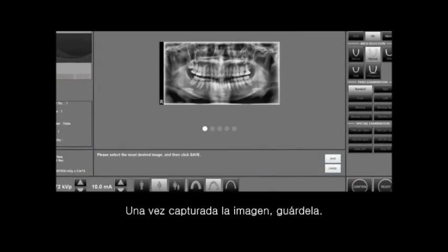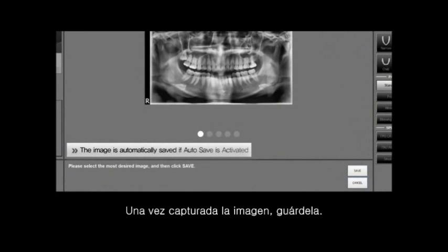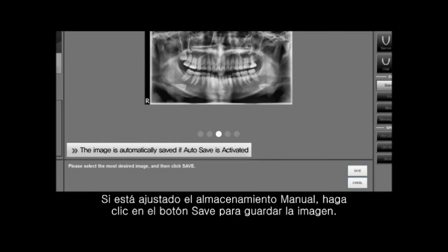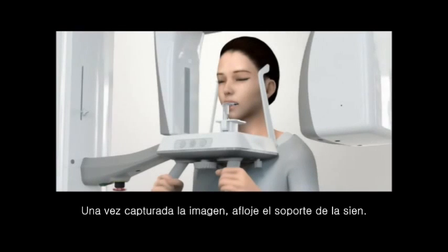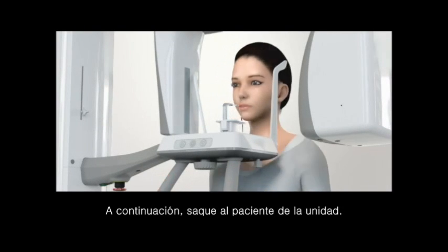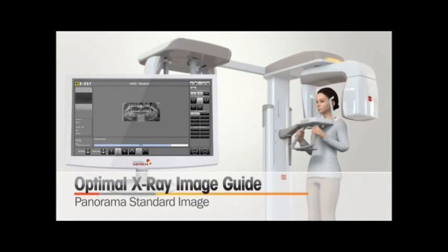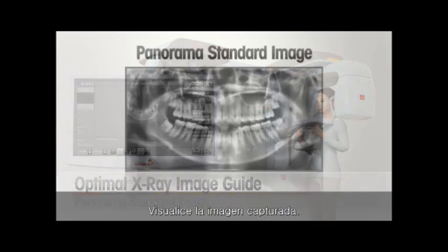After the image acquisition, save the captured image. If you purchased the license of AF mode, select and save the optimal image using the mouse wheel. If the manual save is set, click the Save button to save the image. After the image capturing, unfasten the temple support. Then guide the patient out of the unit. Check the captured image.